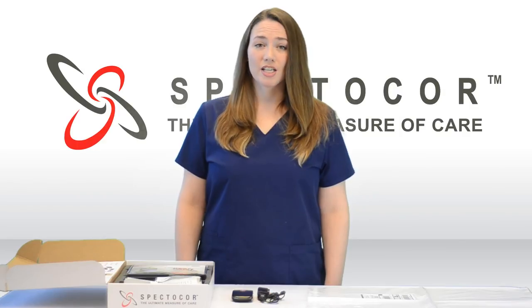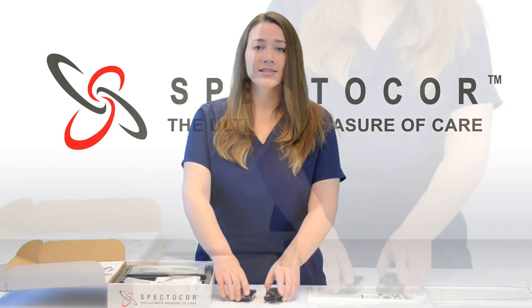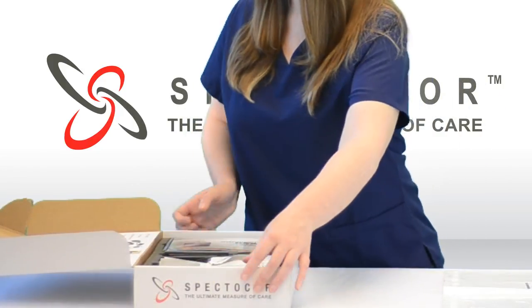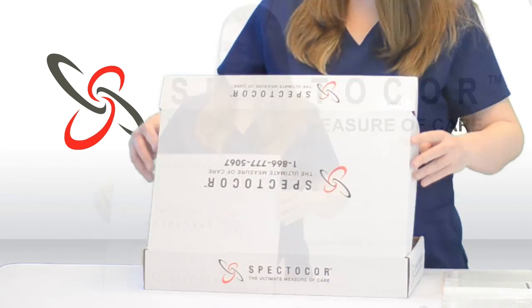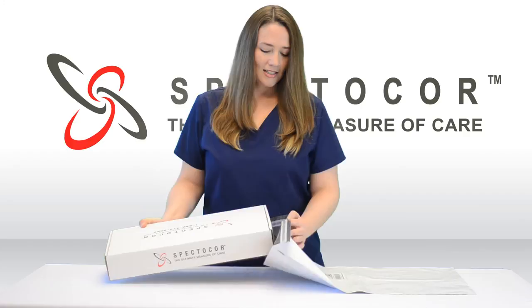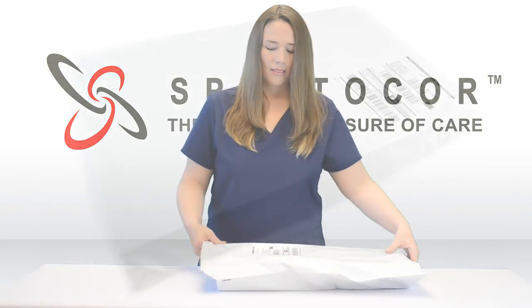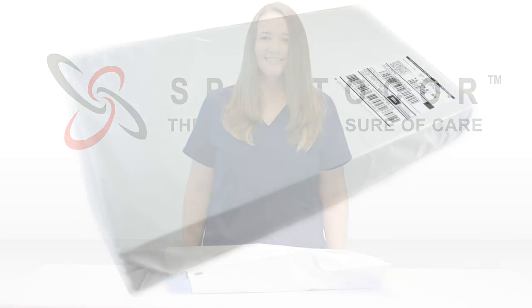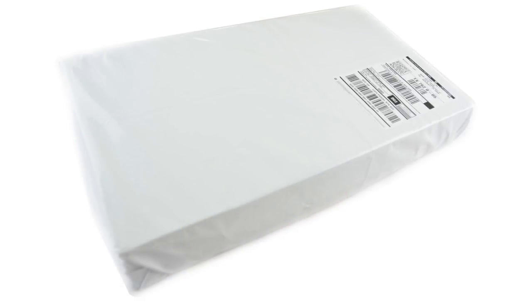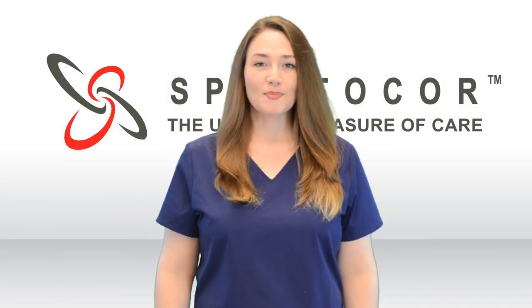Once your study is finished, remove the battery from the heart monitor, turn your PDA off, and put everything back inside the box. Place the monitor box inside the shipping bag. You can call U.S. Postal Service for a pickup, take it by a local post office, or drop it off at a UPS drop box. Thank you for choosing Spectacore, the ultimate measure of care.